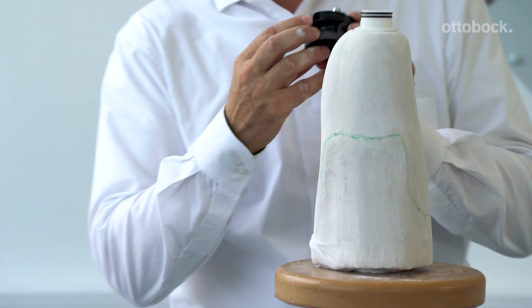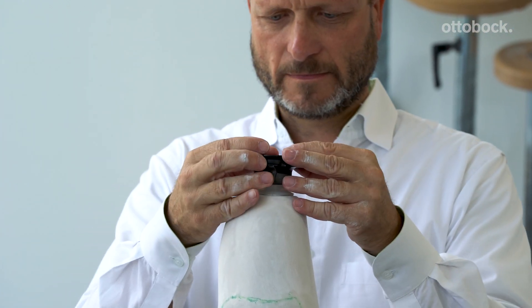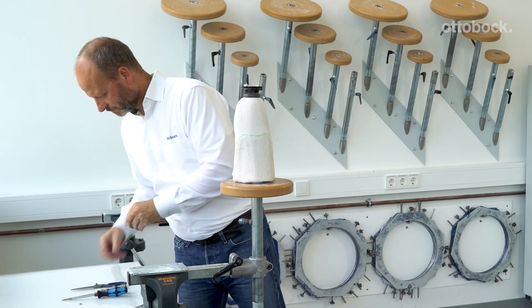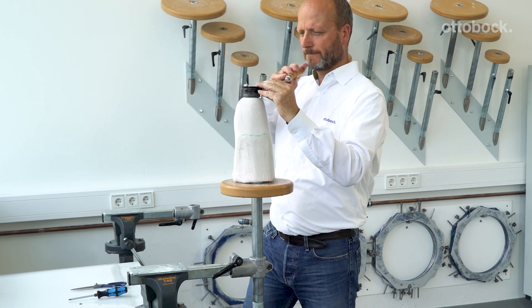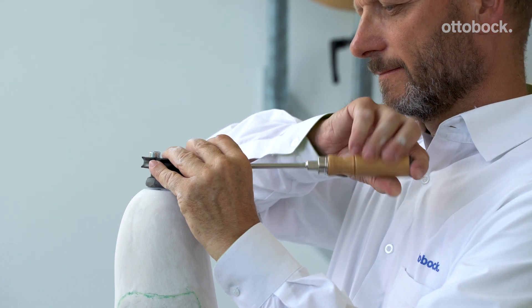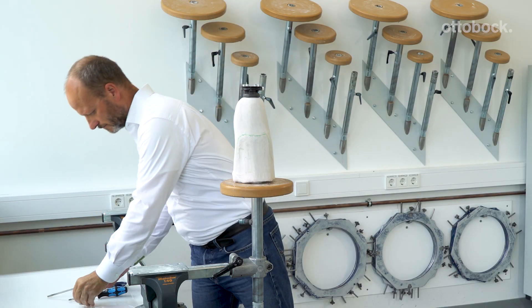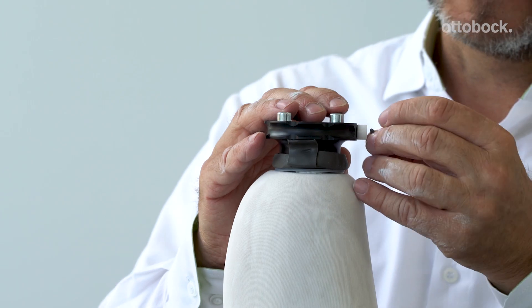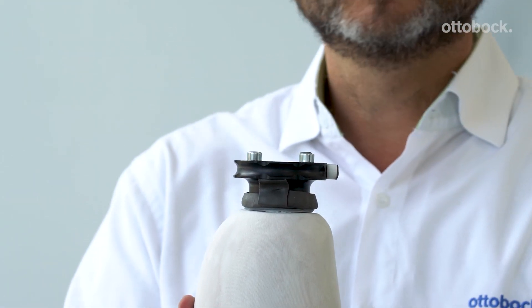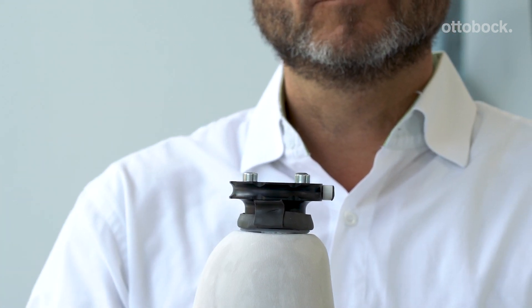Place the DVS pump on the piston dummy. Note that the orientation of the valve is on the medial aspect. Take the valve dummy and screw it in place. Take more Plasta band and cover the valve dummy. When using the 4R220 pump, also cover the cap screws with a small piece of Plasta band. Now drape as you normally would.